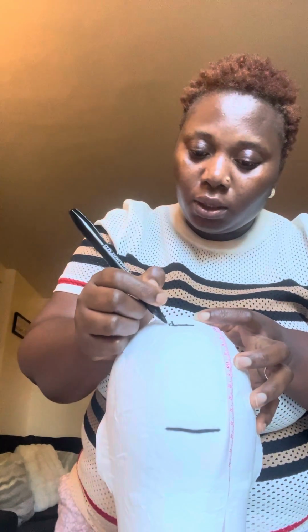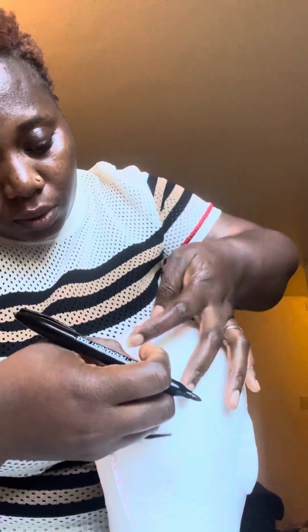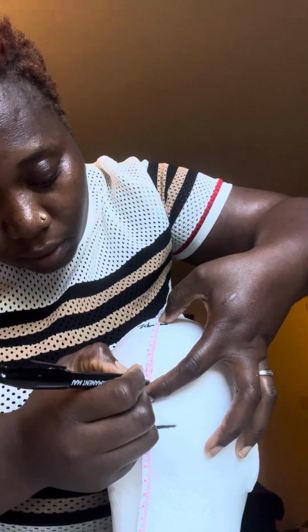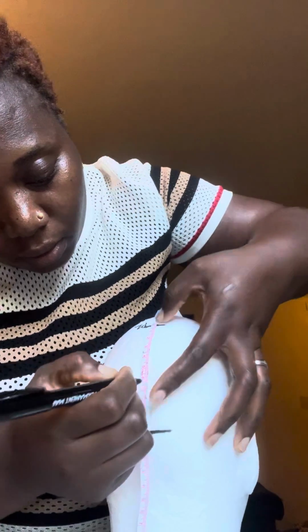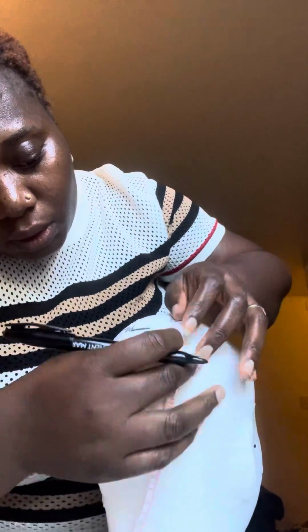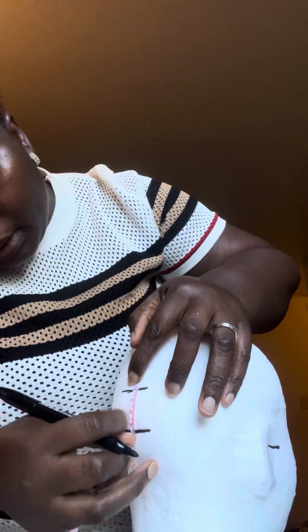Then 20% from PZ to your true OZ. Here's your OZ. Then you've got to check. So 10% from your true OZ to your inion.